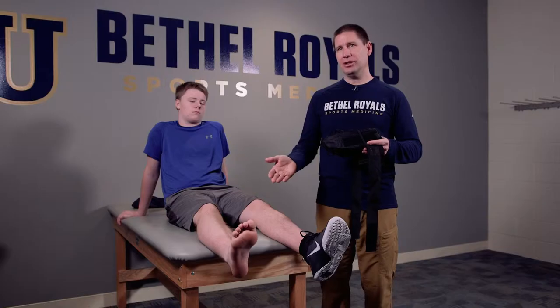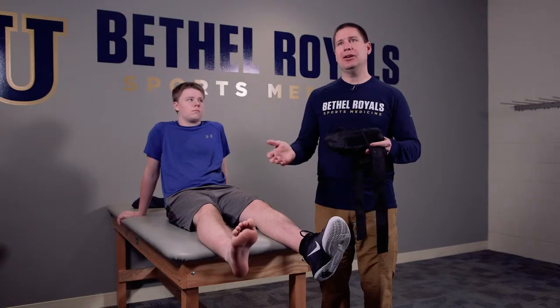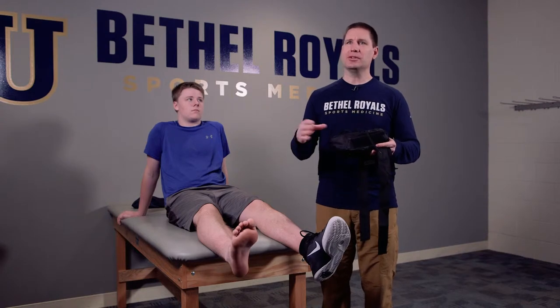The majority of them are going to keep the ankle in a fairly neutral position, preventing it from either inverting or everting. The majority of all ankle sprains are going to be inversion ankle sprains, so you really want the lateral protection.